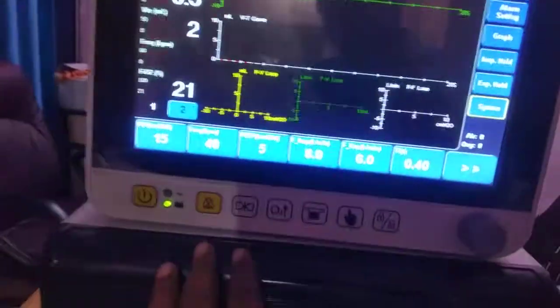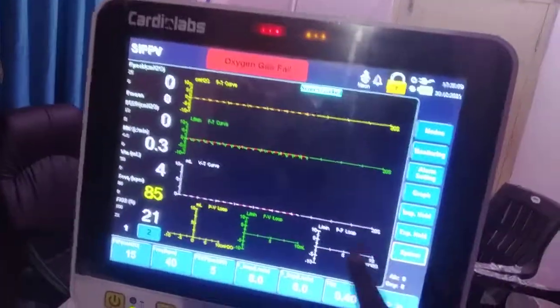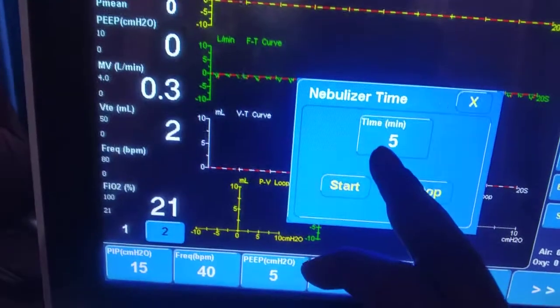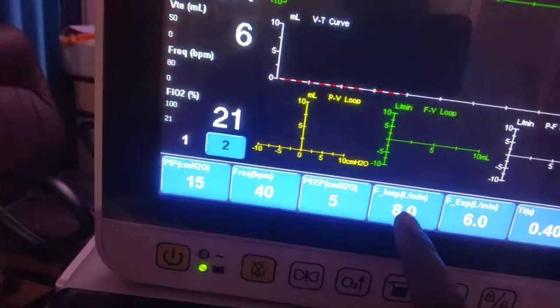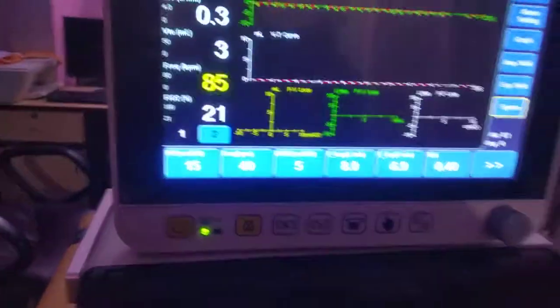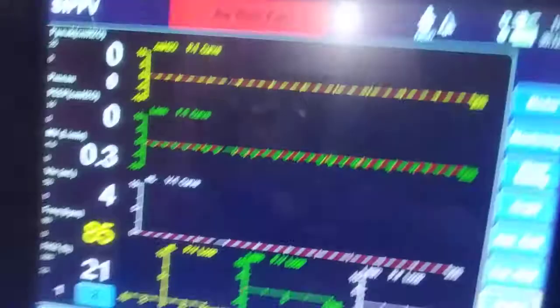This is your system menu — from here you can do calibration, view system info, and access setup. These are the hotkeys: this button is for screen lock, for safety purposes, and you can unlock it by pressing for a few seconds. There is a direct nebulizer button — press it, select the duration, and start the nebulizer. There is also an O2 button: pressing it brings FiO2 to 100%, which is required for auto-suctioning procedures.